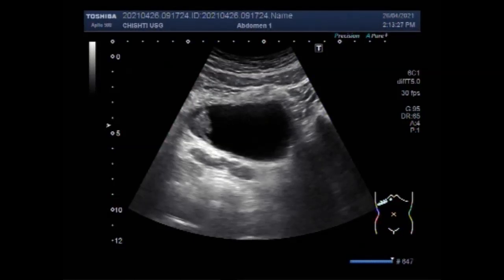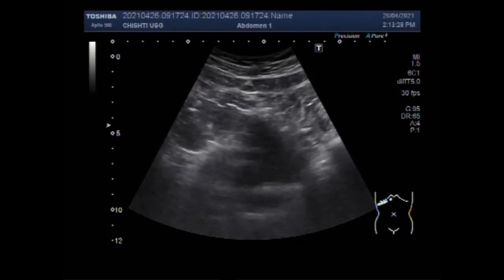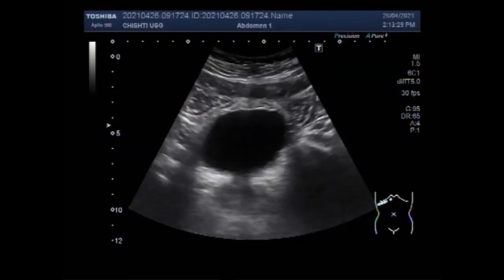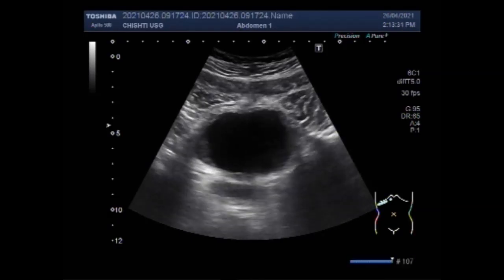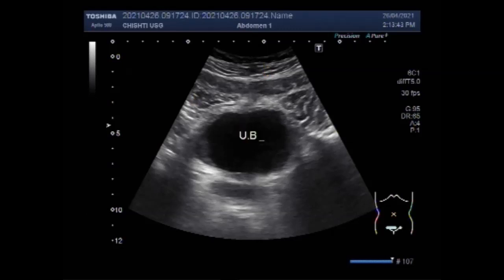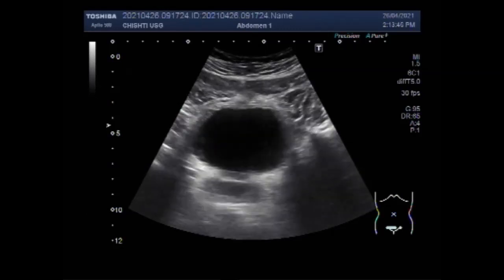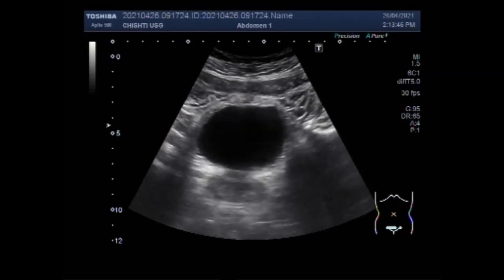Dear viewers, I hope you are all fine. This ultrasound video shows a vesicle growth, a mass in the urinary bladder. An ultrasound scan is used to show if a growth is present and how large it is. Ultrasound cannot always find small tumors, so additional tests may be required.